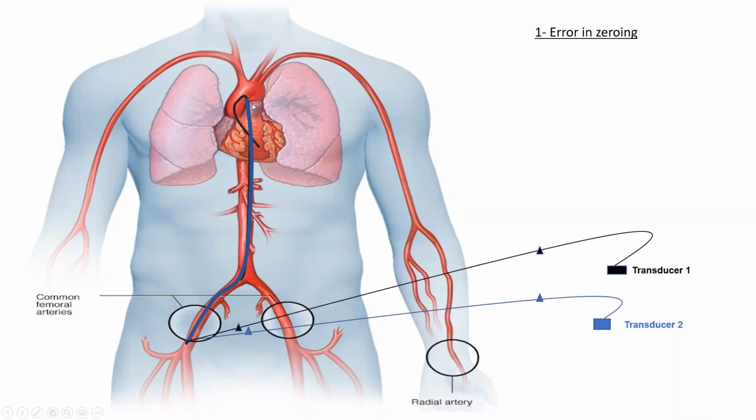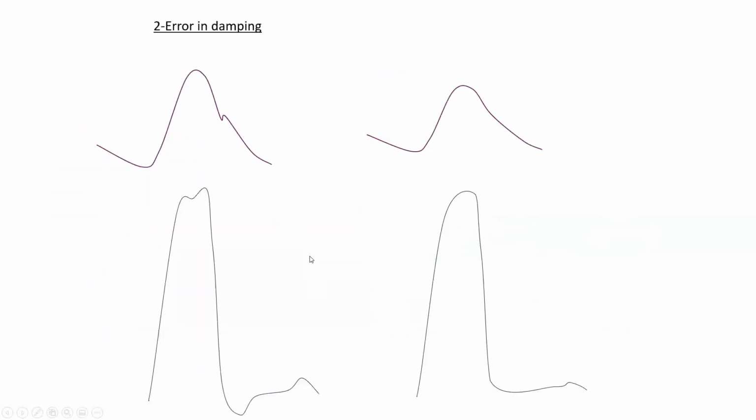Or if actually the catheter is too small. So sometimes, let's say you have a 5 French sheath, and inside it you put a 4 French catheter, you may have too little space to transmit pressure and your pressure will be damped. So too small of a catheter can damp your recording, okay? So those are the various reasons to have damping.